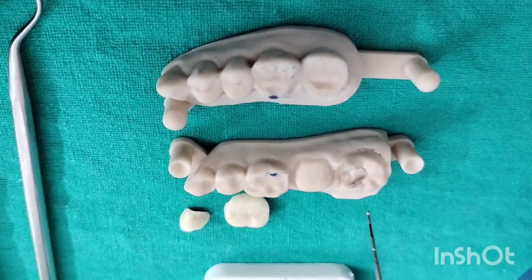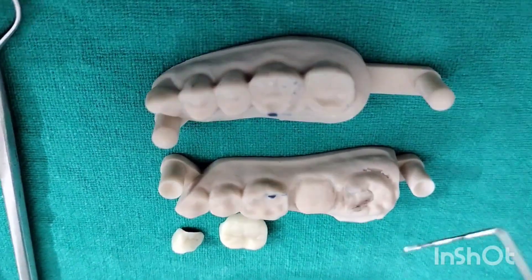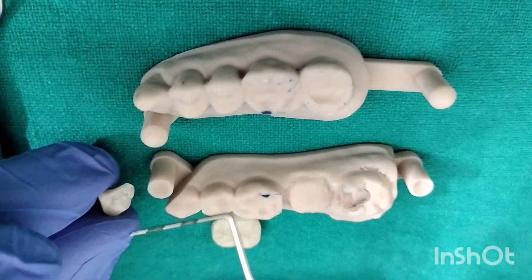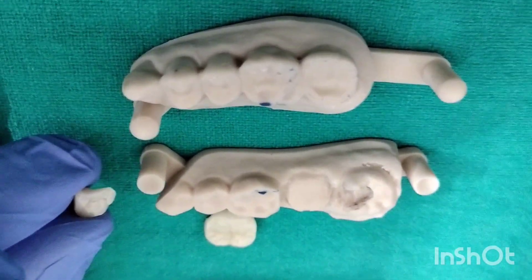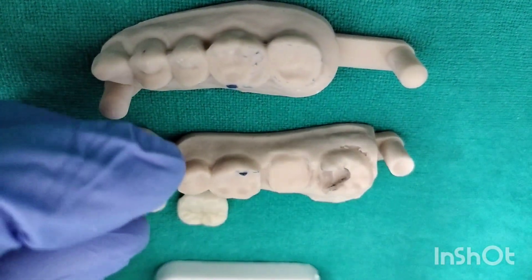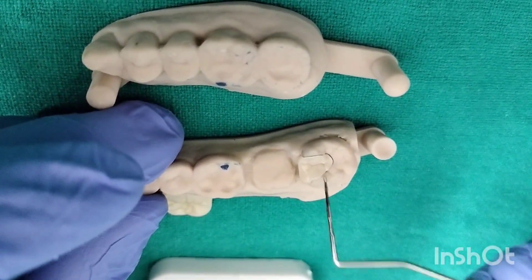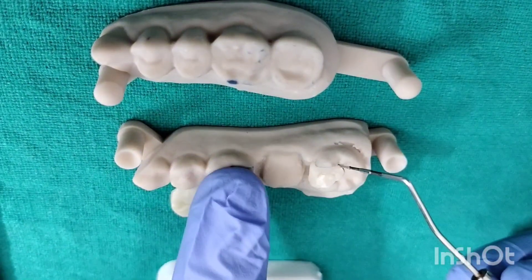Here we have the 3D printed model of the scan of the prepared cavity which you can appreciate here, and this is the all ceramic inlay which I was talking about. First, you have to take this inlay and try it into the prepared cavity. You can use a try-in paste for this. We apply a try-in paste onto the internal surface of this proximal inlay and then apply it onto the prepared cavity. Check for the color and contour of this inlay onto the prepared tooth. Once you are satisfied with that, we start with the bonding procedure.